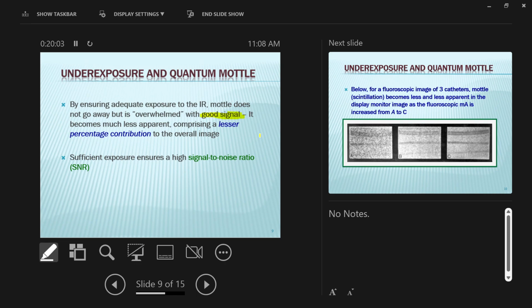So you take the body thickness, and you calculate some mAs for it. Remember the 4 centimeter rule for mAs? What's the 4 centimeter rule say? For every 4 centimeters, you double the mAs. So a body part that's 4 centimeters thick takes 10 mAs. Another person comes in with an 8 centimeter same body part. Go to 20 mAs, right? Double it.